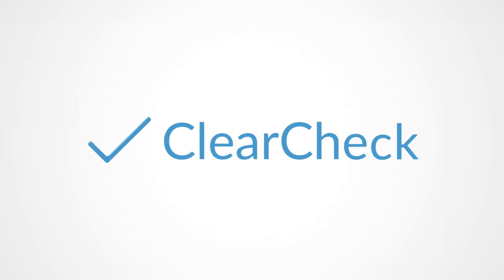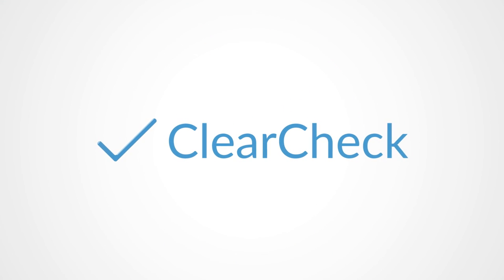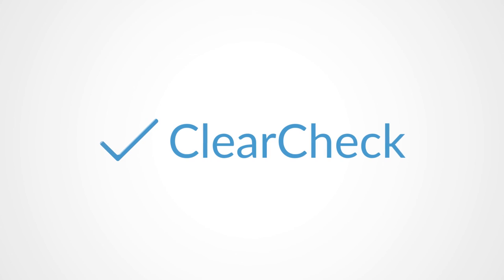This has been a quick look at conformity index within the ClearCheck software. ClearCheck. Efficiency through simplicity.